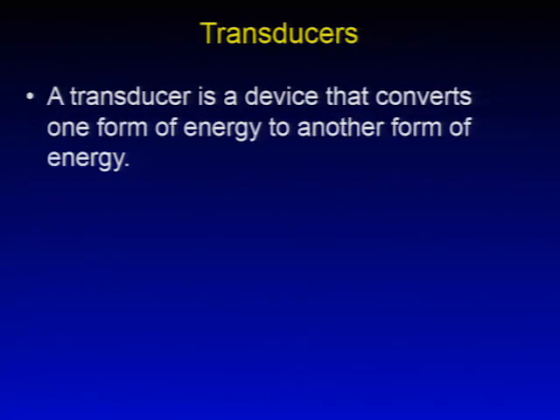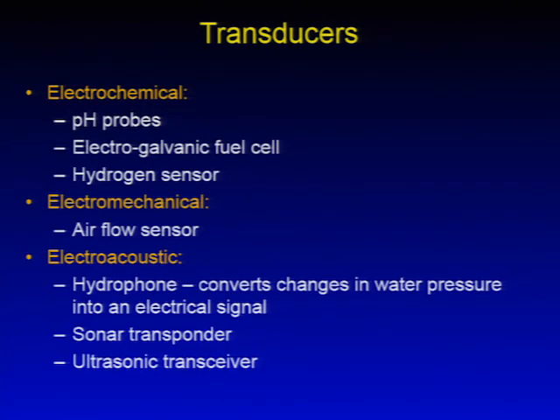So, transducers. A transducer is a device that converts one form of energy to another form of energy. There are so many kinds of transducers.